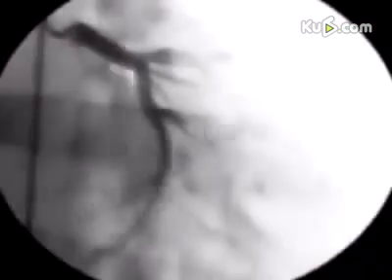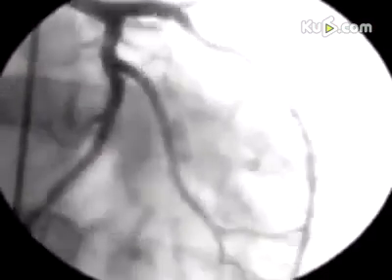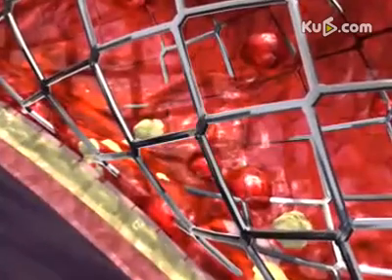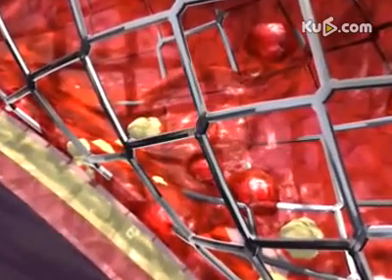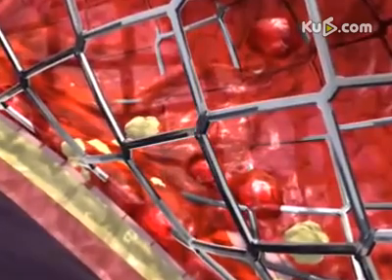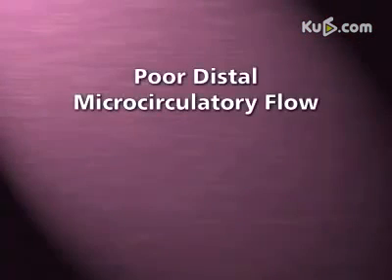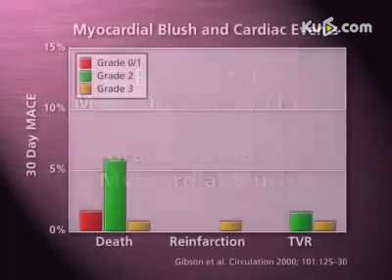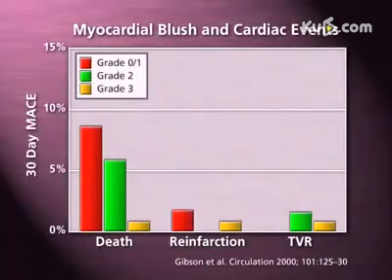Although the angiographic result is quite acceptable, a significant amount of residual thrombus persists, both at the stent edges and adherent to its struts. The poor distal microcirculatory flow, as assessed angiographically by myocardial blush, strongly correlates with poor clinical outcome.